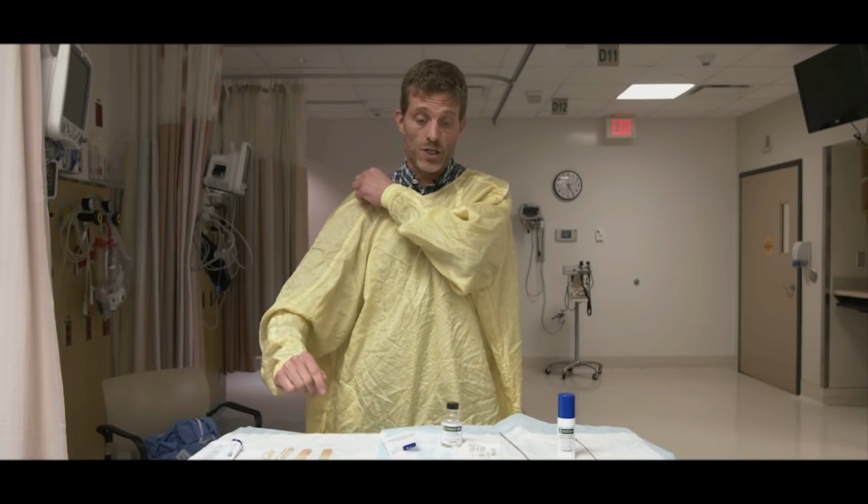And maybe we even evolve, if we start doing this enough, to having a paper checklist. But have your checklist, so you have all your equipment. All your equipment is going to be very similar to your regular RSI checklist. I suppose the additional stuff is patient positioning, which will be different, obviously in a chair, and the topicalization dosing.